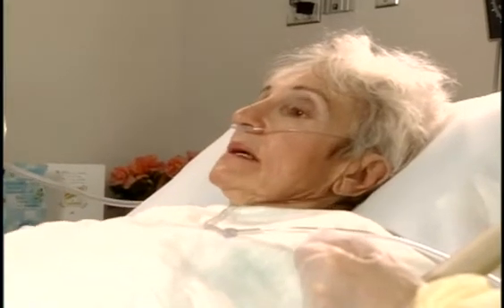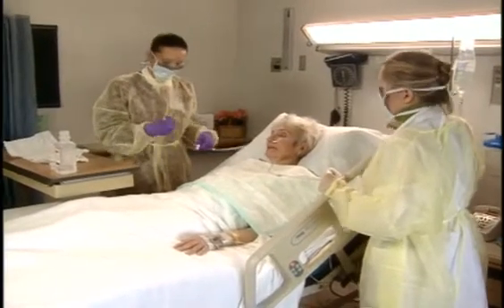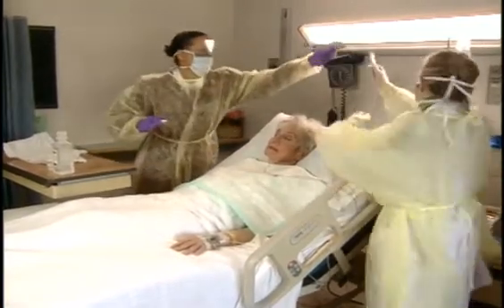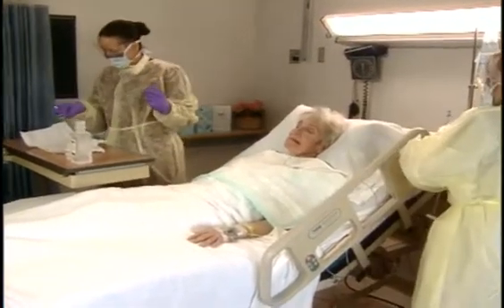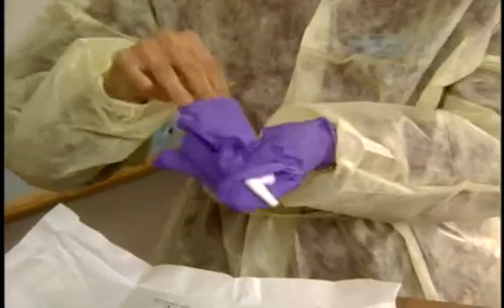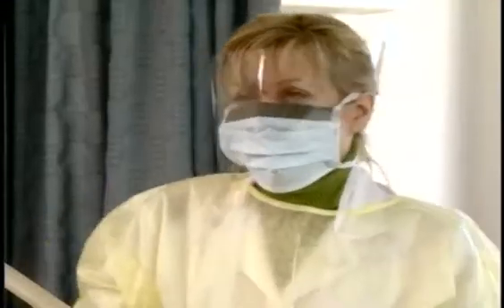All right. Take some deep breaths. Good. Okay. Very good, Mrs. Marconi. I'll just wrap the catheter inside my gloved hand and remove my gloves by containing the catheter inside the gloves. Great. Now dispose of them and any other used supplies in an appropriate container. And let's get out of our PPE.